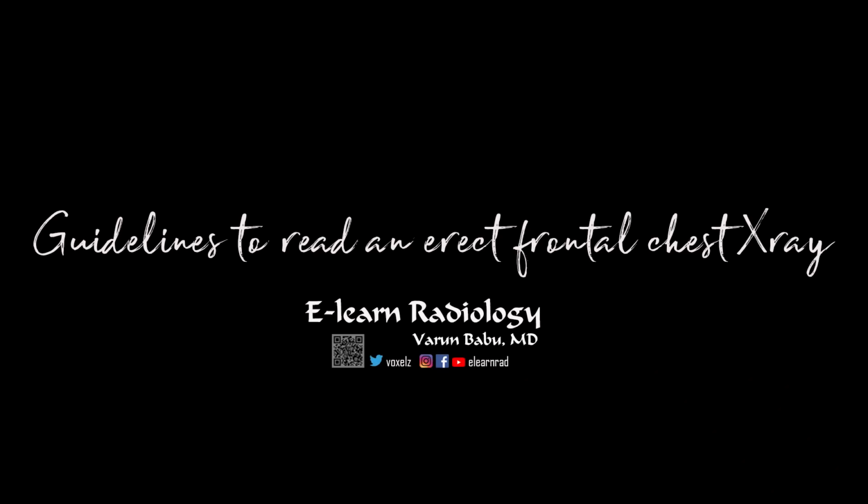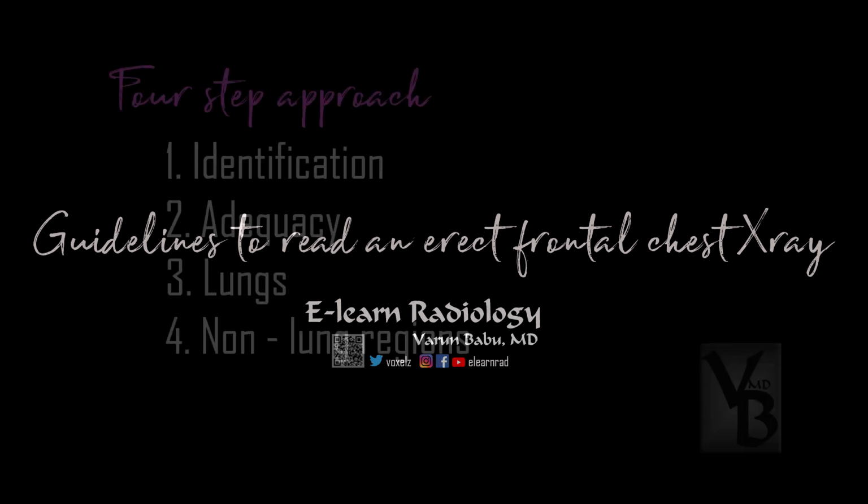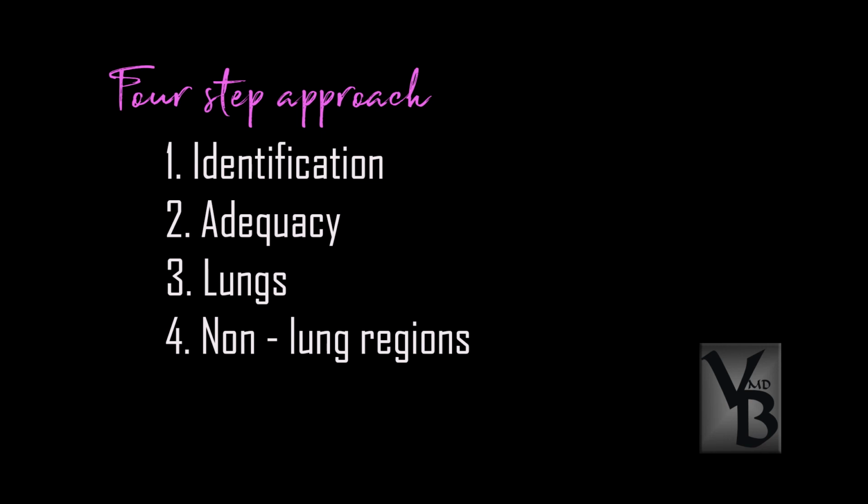Welcome to the first episode of the series on chest X-rays. We are going to kickstart with a concise, systematic approach to reading the chest radiograph. In a 4-step approach, we are going to see how to identify the image, check out if it is adequate for reporting, see the areas of interest.